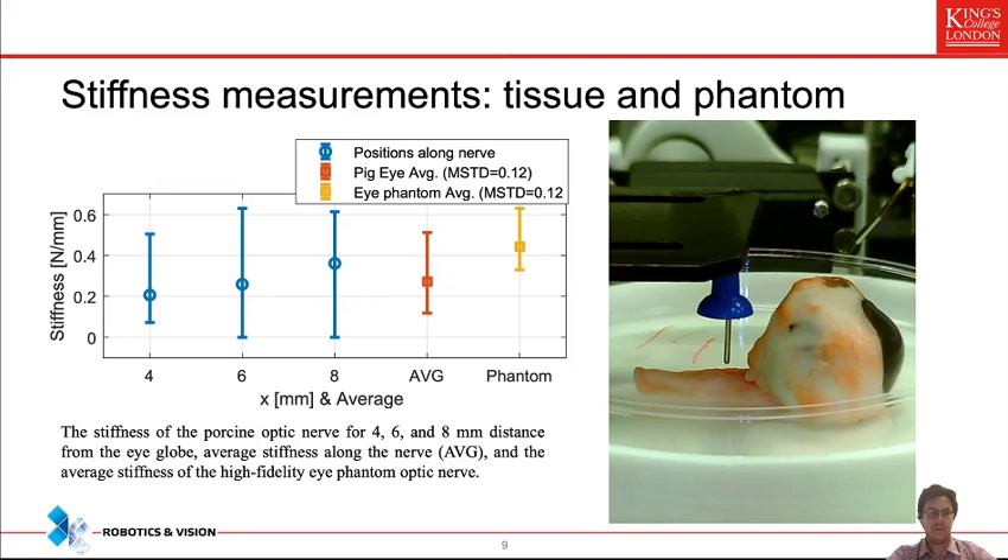The porcine eye is a good model of the human eye — and actually a little bit stiffer. So if we are able to do manipulations on the phantom eye and on porcine eyes, our robot is able to meet the requirements for force delivery and navigation in the clinical application involving human tissue as well. We confirmed that the phantom stiffness with regard to the optic nerve is similar to the porcine eye.